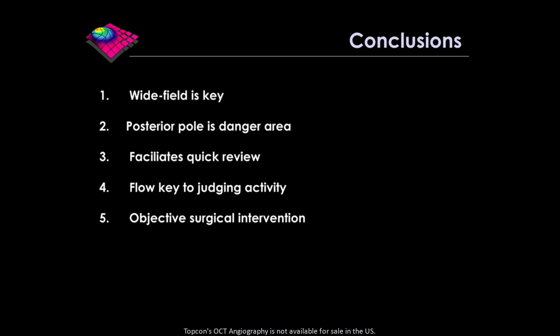I think it may help with objective surgical intervention, and this is again born from my frustrations about when is the appropriate time to surgically intervene. And we certainly have some patients with tractional retinal detachments that are not involving the macula that have been stable for a long time. And actually, you would probably do the patient more harm than good by jumping in. But this is a first way for us to try and objectively quantify those things. And really, I would say there's lots more to come.